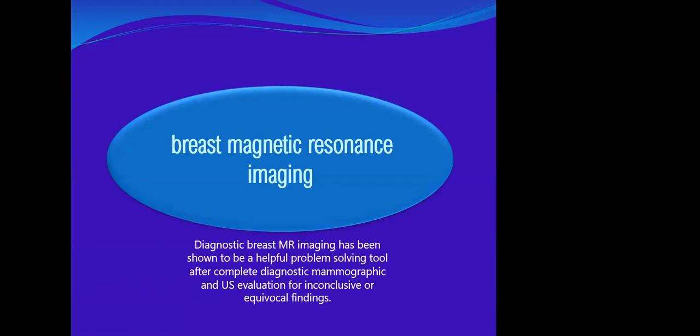Okay, what about the breast magnetic resonance imaging? It has been shown to be a helpful problem-solving tool after complete diagnostic mammographic and ultrasound workup for inconclusive or equivocal lesions.